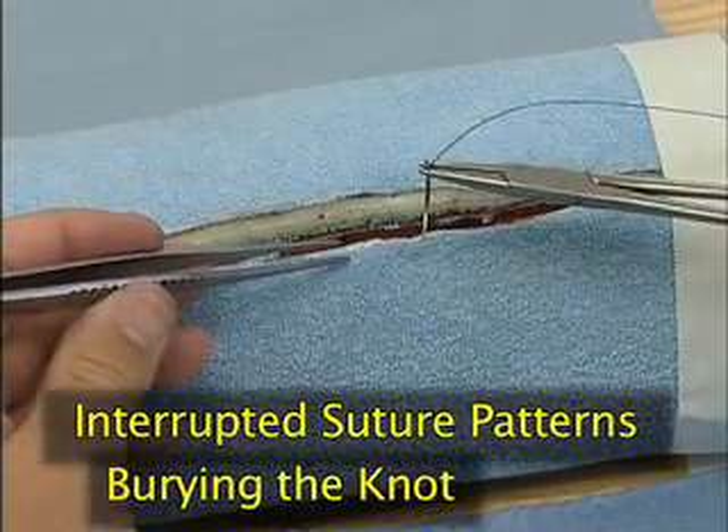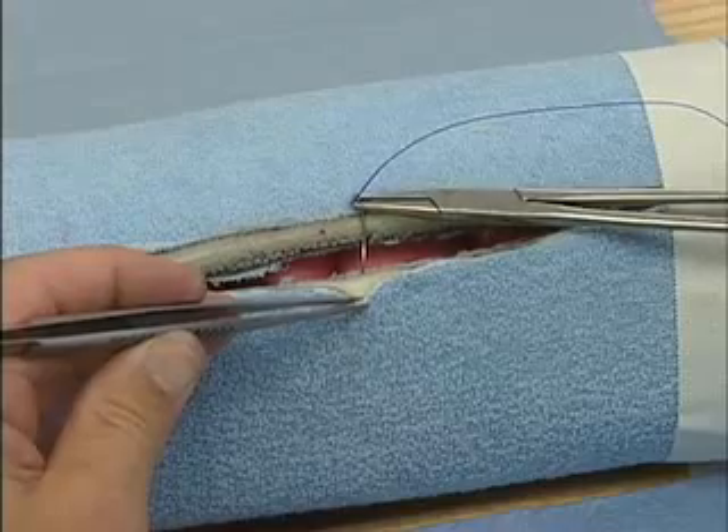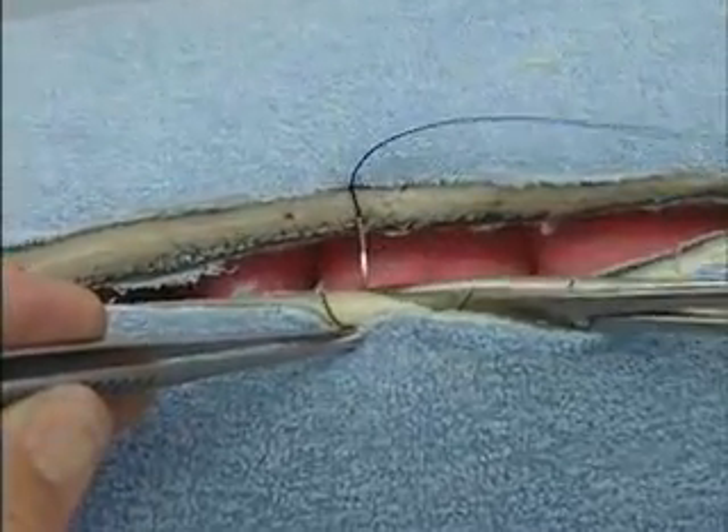We'll now demonstrate burying the knot. The needle is placed into the incision on the same side as the surgeon, and the suture is passed from deep to superficial.